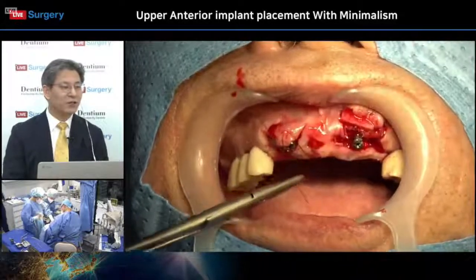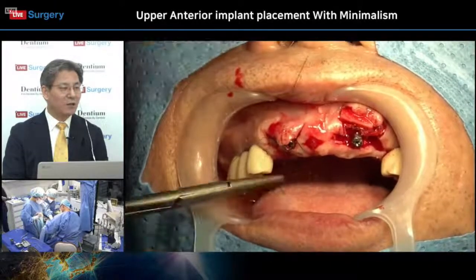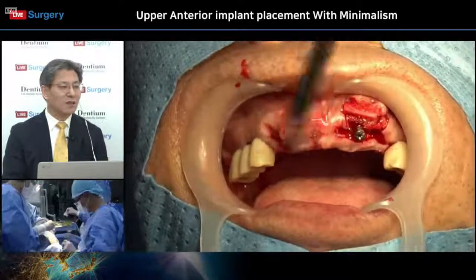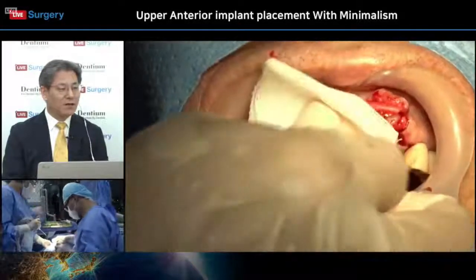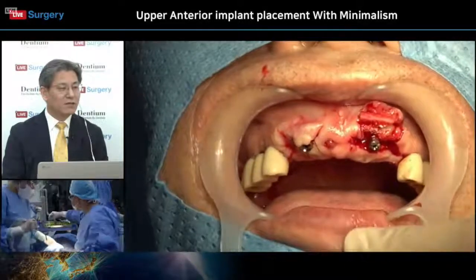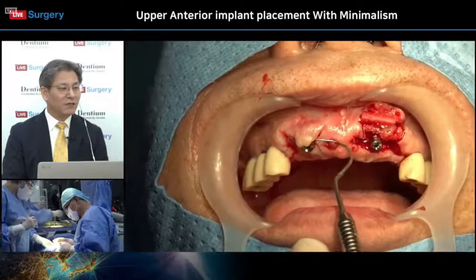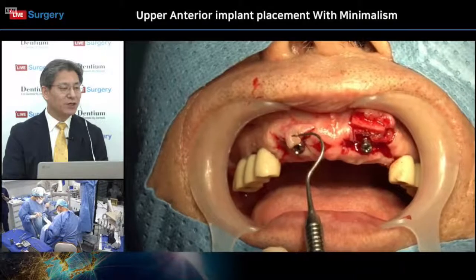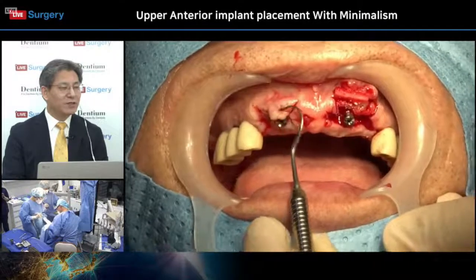Concerning these biomaterials, as far as I know, this Osteon 3 collagen and collagen graft is very nice and a host-tissue-friendly grafting material. So very nice, good healing situations will be found after using these grafting materials.